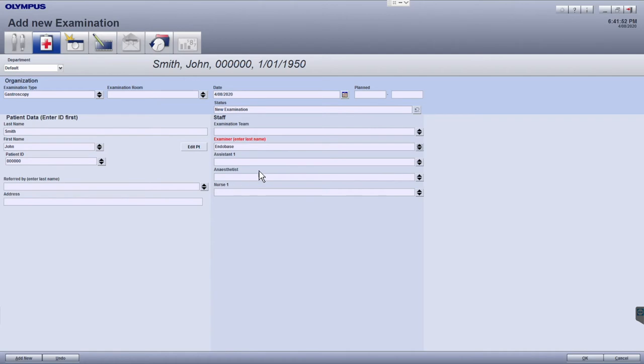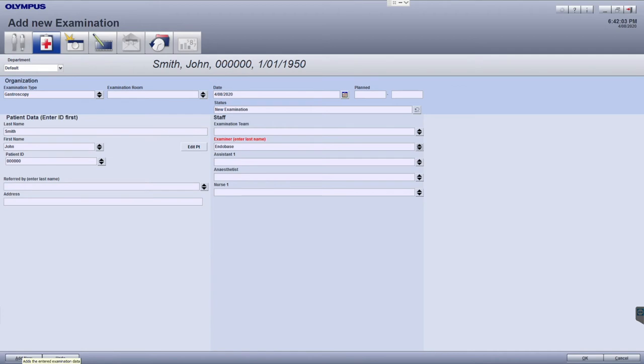After all examination details have been filled, you can either click the OK button to save this examination or the Add New button to add this examination and begin populating the next examination in the list. If no more examinations are to be added, click the OK button to return to the scheduler.